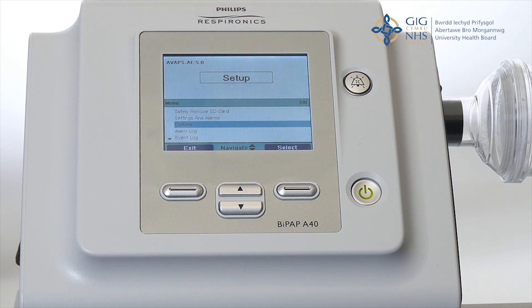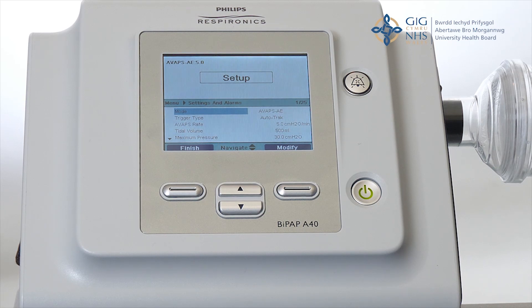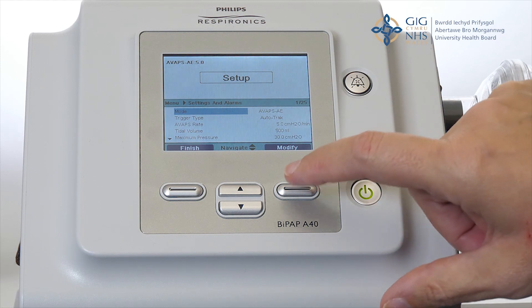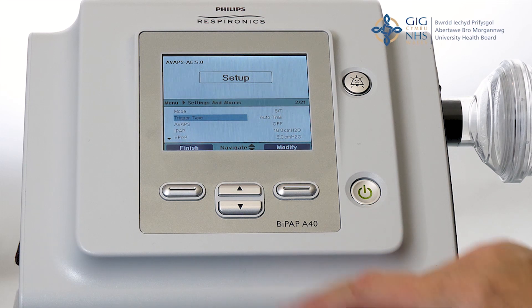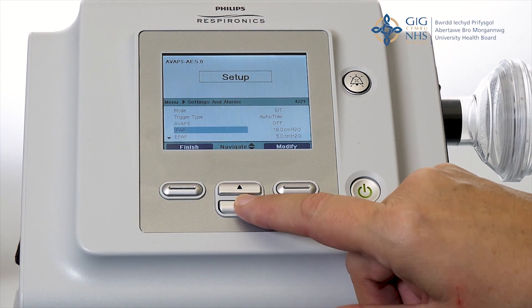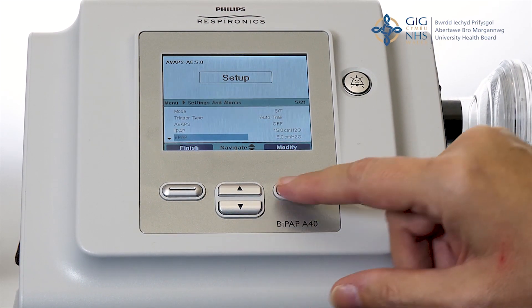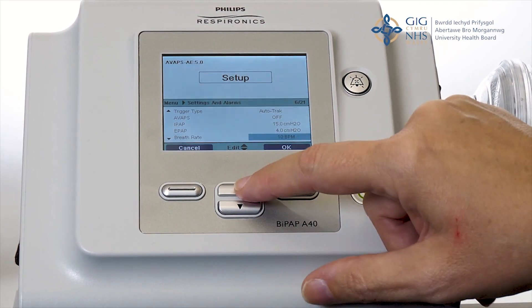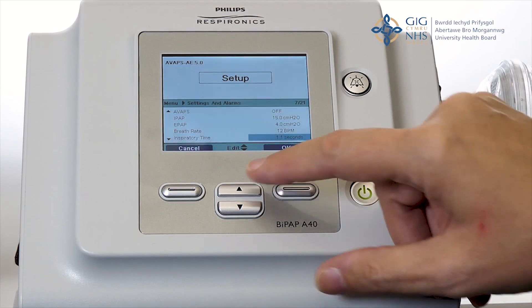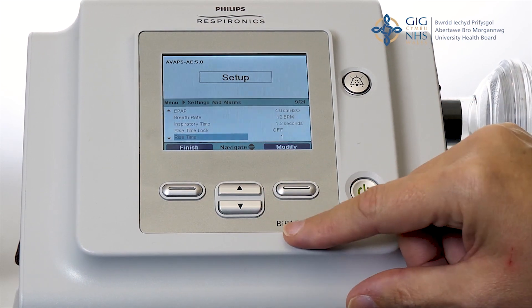Now you can scroll up to settings and alarms and press select. The machine delivers a number of modes. We need spontaneous timed which shows as ST. Trigger type is auto track. AVAPS is off. The IPAP should be 15 centimeters of water. The EPAP should be 4 centimeters of water. The breath rate should be 12. Inspiratory time should be 1.2 seconds. Rise time lock off.